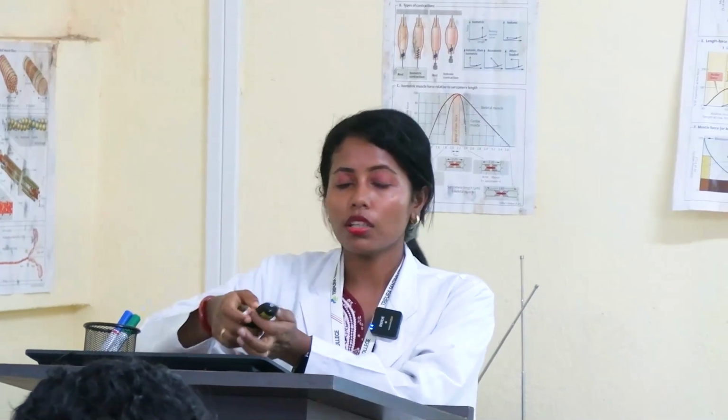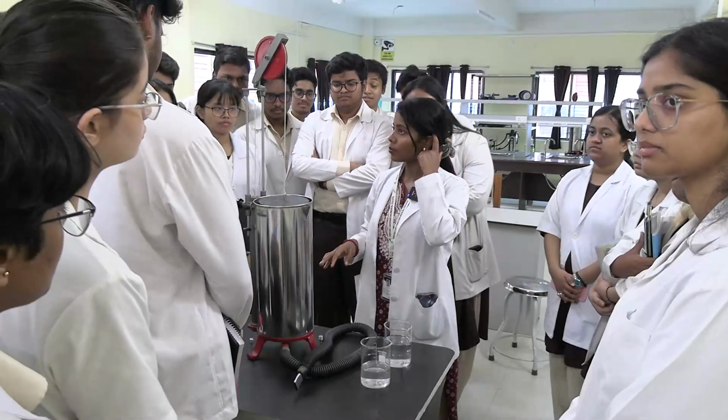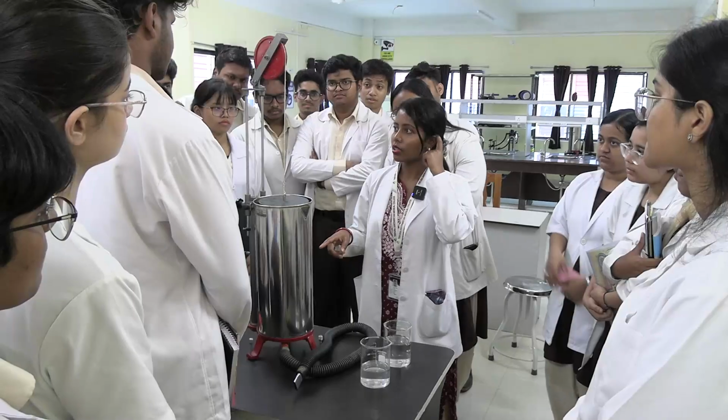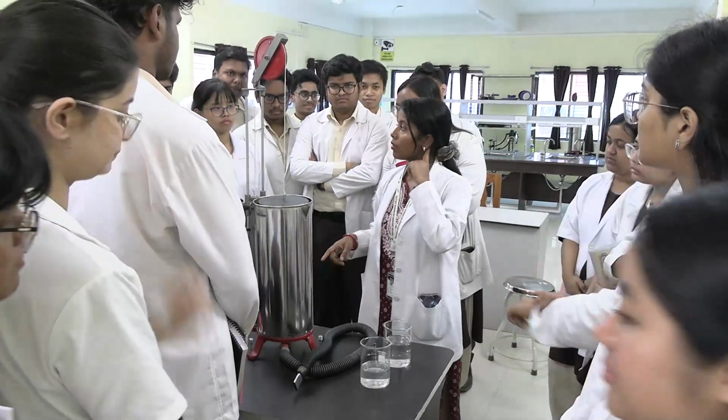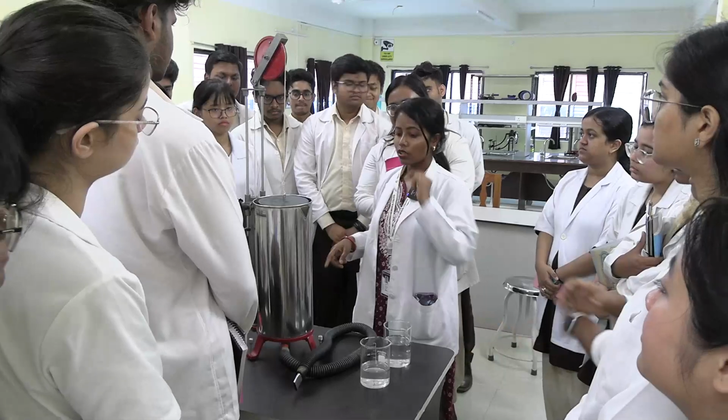Now let's go to the clinical lab. I'll show you how to perform the vital capacity in the student spirometer. We have a student spirometer and a digital Helios spirometer, so today we'll be doing both. Now let's go to the clinical lab or simple spirometer. You might get this in your exam, where you will be asked to perform vital capacity.